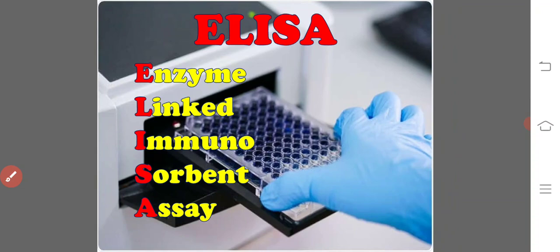ELISA, abbreviated as Enzyme Linked Immuno Sorbent Assay. This is a solid phase immune assay. This assay is used to measure the amount of either antigen or antibody.